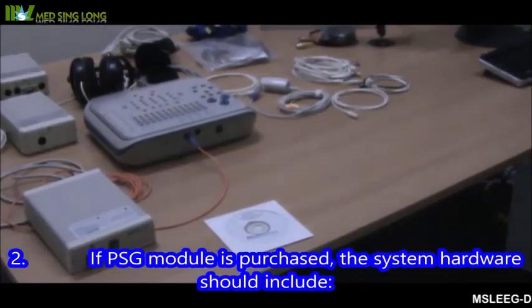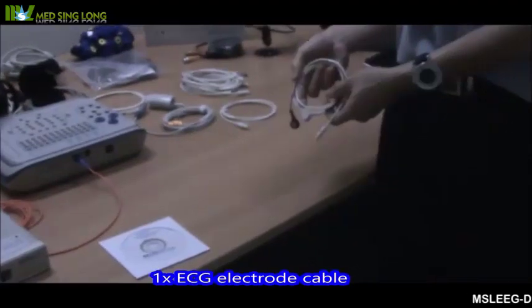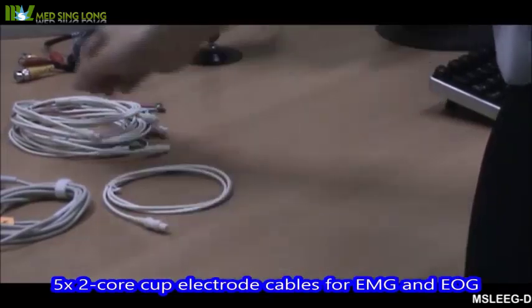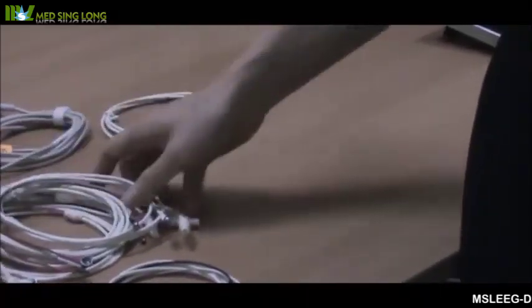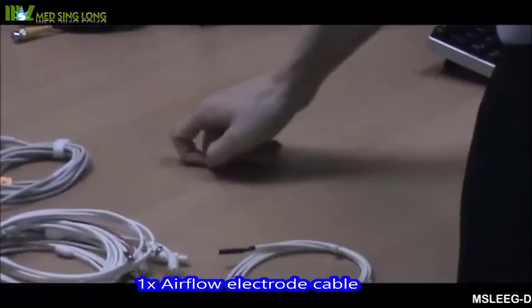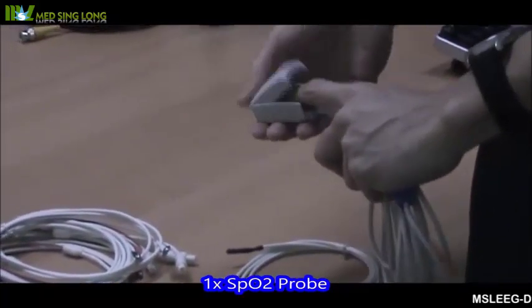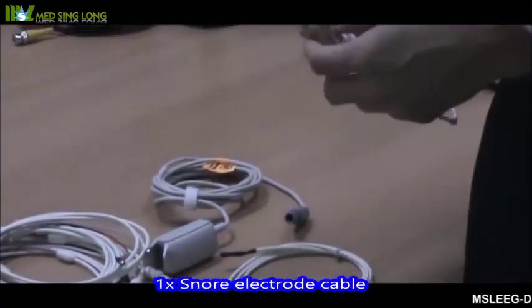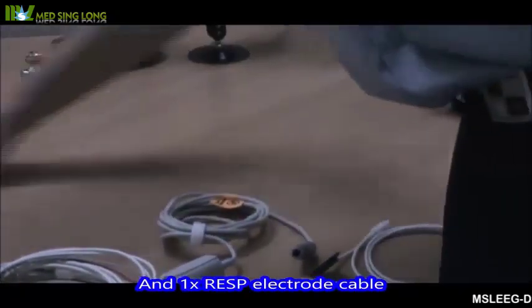2. If PSG module is purchased, the system hardware should include: 1x ECG electrode cable, 5x 2 core cup electrode cables for EMG and EOG, 1x airflow electrode cable, 1x SpO2 probe, 1x snore electrode cable, 1x RESP electrode cable.